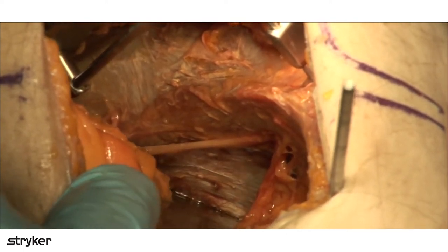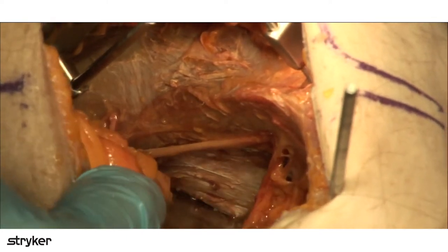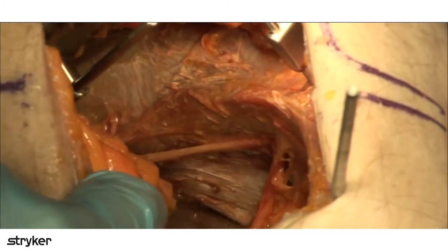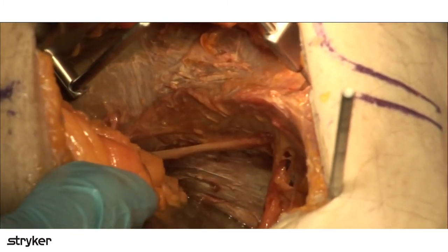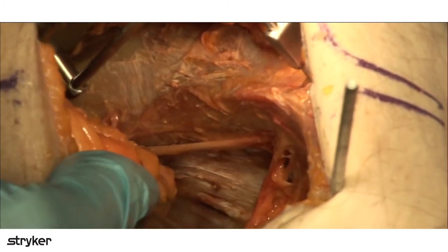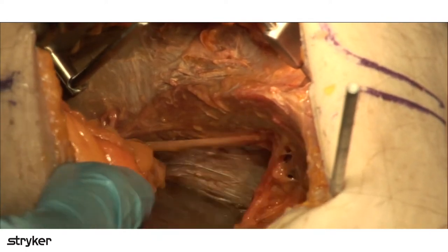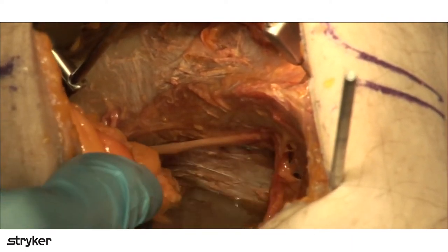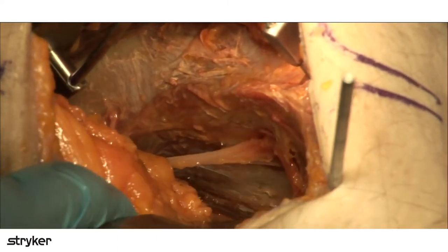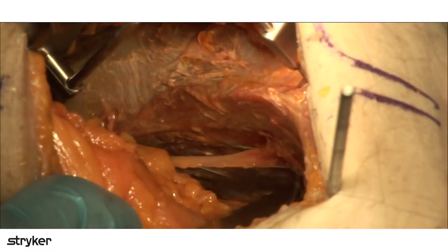And that is that if you start doing a lot of things in the greater sciatic notch without really being careful, you can actually hit the sciatic nerve, and it's under tension. So just be careful. I put retractors and reduction clamps in the greater notch all the time, but you just have to be careful because you can get sciatic nerve palsies back here, all right? So you can see that we got exposure all the way down to the ischial spine. We see the entire medial surface of the posterior column from the greater notch, which is right there, all the way down to the ischial spine, which we can't really show you with these camera angles. All right, right up to the obturator foramen.